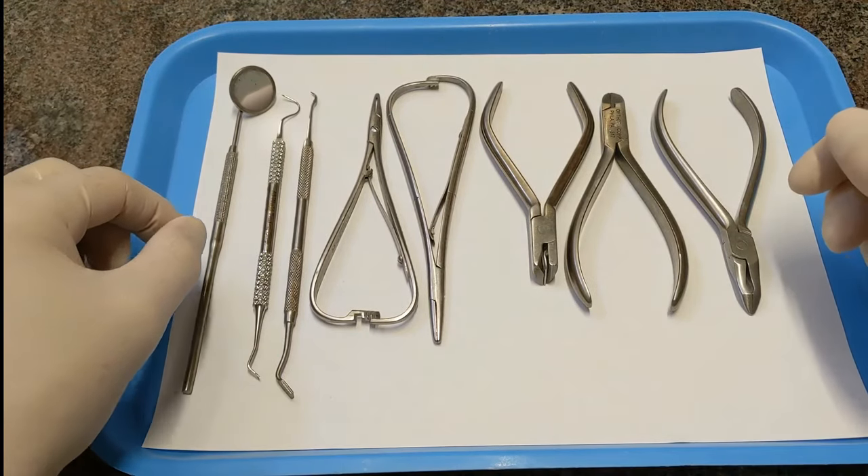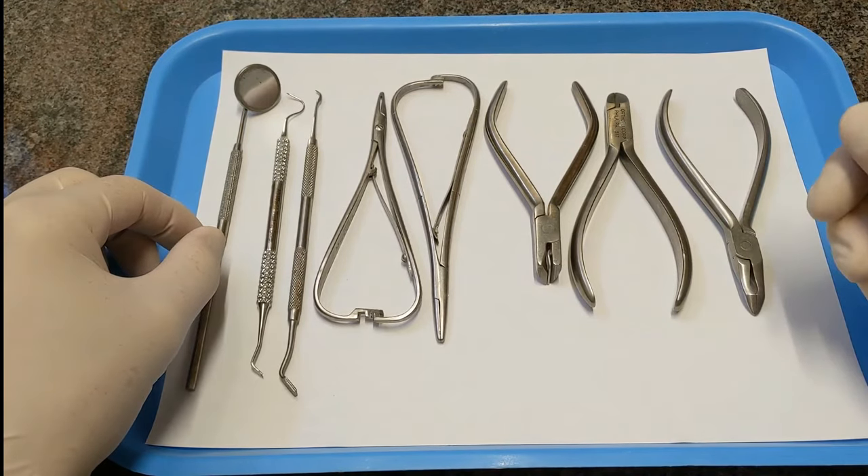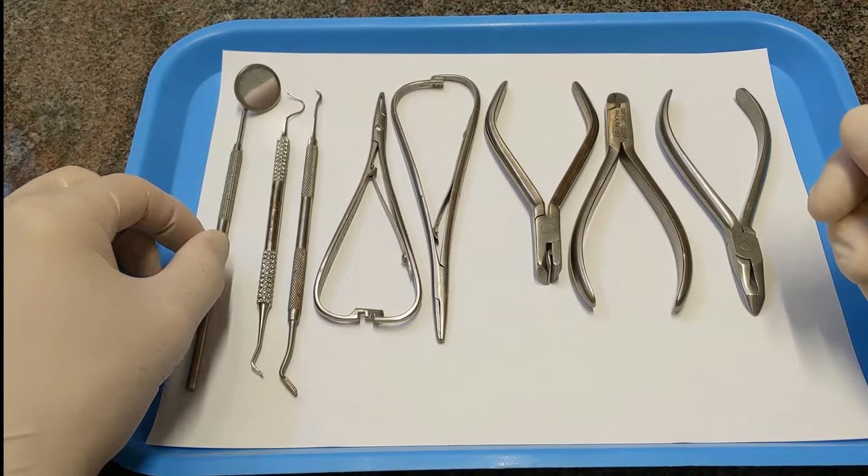We're going to go over the instruments that we commonly use in the orthodontic clinic. We'll just go through them one by one and I'll explain what each of them are and what their name is.